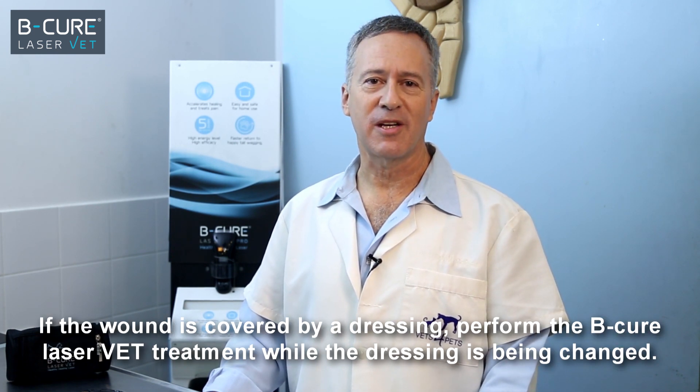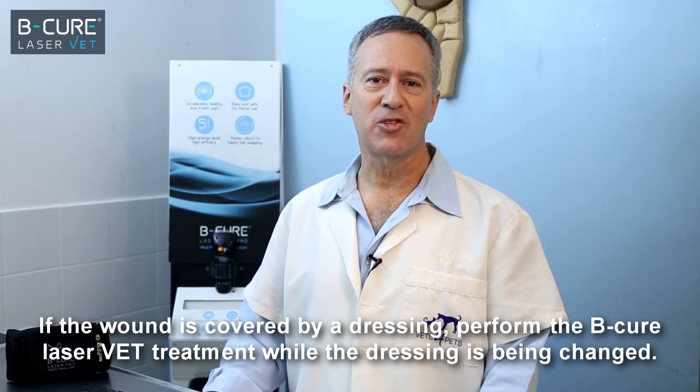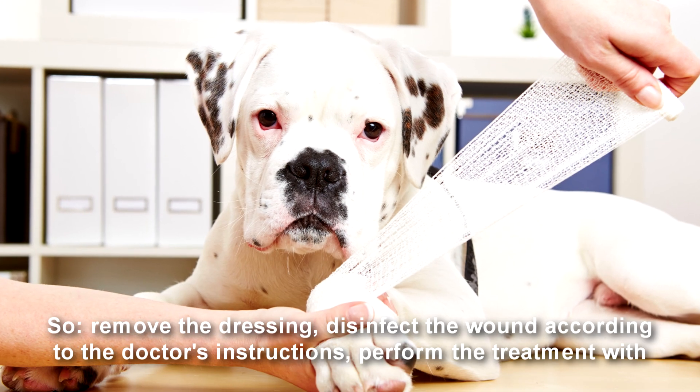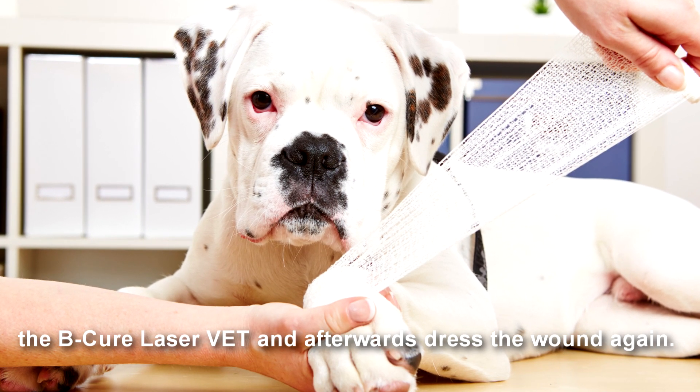If the wound is covered by a dressing, perform the BeCure LaserVet treatment while the dressing is being changed. So, remove the dressing, disinfect the wound according to the doctor's instructions, perform the treatment with the BeCure LaserVet, and afterwards dress the wound again.